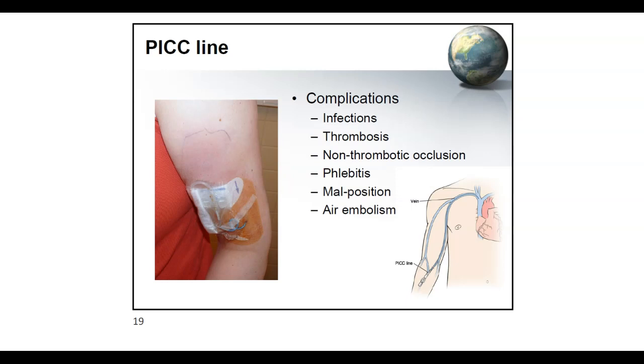Complications from a PICC line include, one, infection, right? You have easy access to the bloodstream, so that can be a source of infection. And thrombosis. Anytime you have something foreign in your body, you can increase your chances of getting a clot. In addition, if the patient is already acutely ill, they're already hypercoagulable at that point, so there is a higher risk for thrombosis.